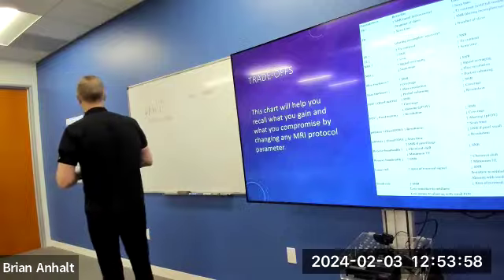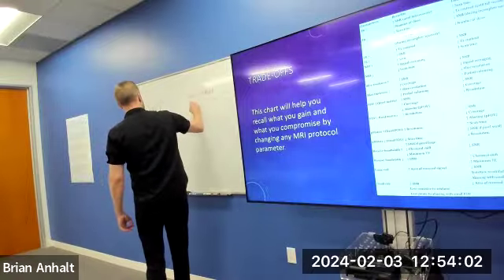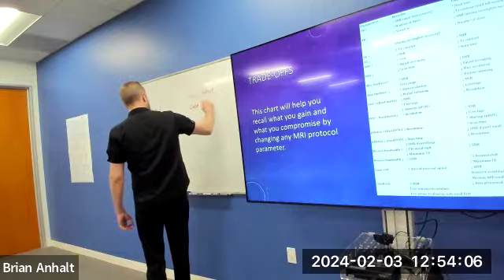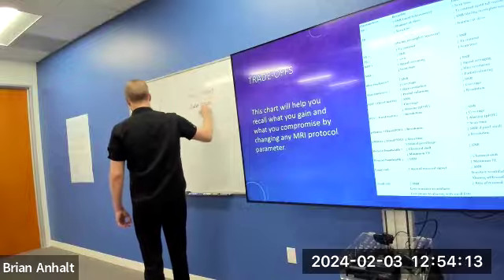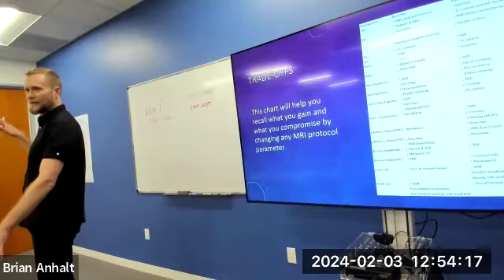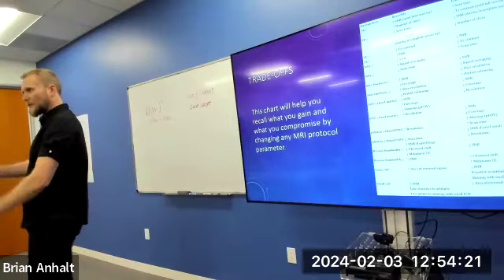What happened to artifacts? Lower the chemical. Yeah, chemical shift. Does it get better or worse? It decreases. If I'm raising the bandwidth, I'm putting more frequencies in a smaller area, bringing fat and water closer together.